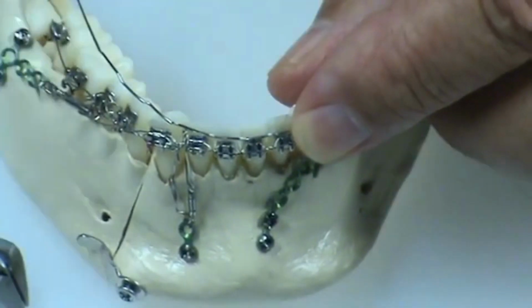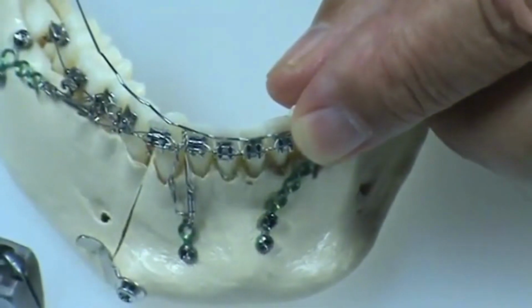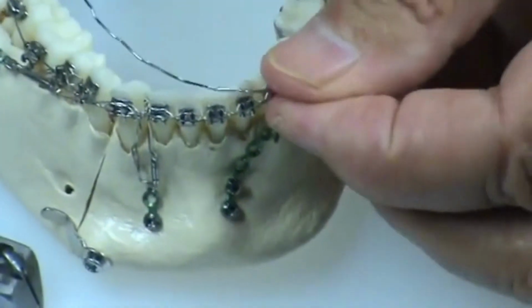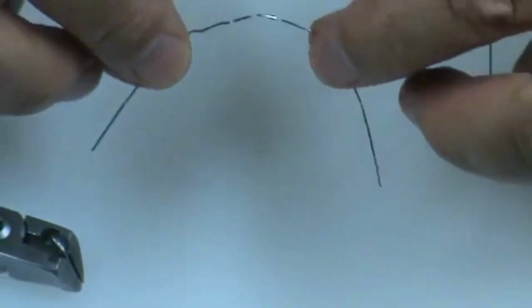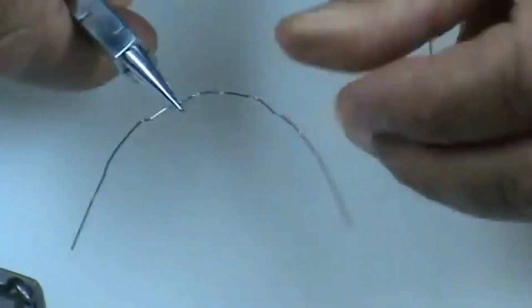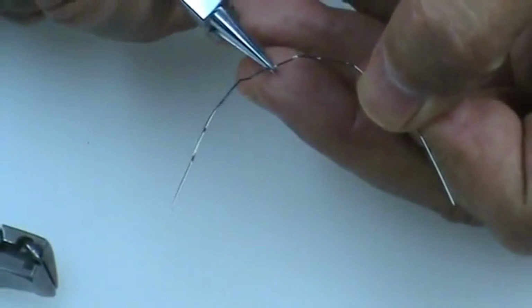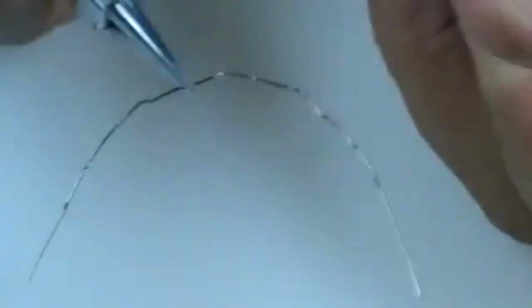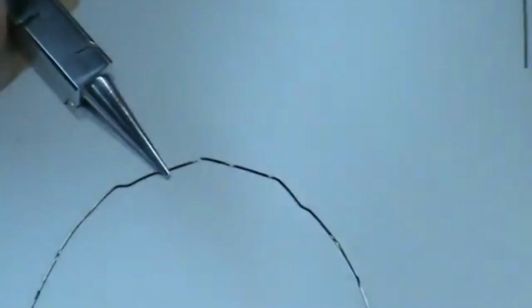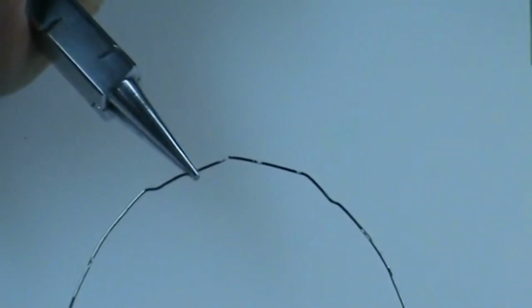You make bends again on the mesial and distal of 3-1 and 4-1. Okay? Thank you, patient. You take the wire out. You orient it towards yourself so that you can see and make sure you don't bend it the wrong way. And you're going to get the plane here correct. I want to go straight up. Okay? And I think I'll start here.